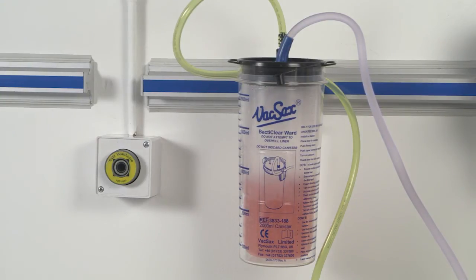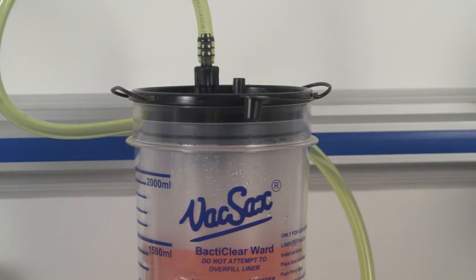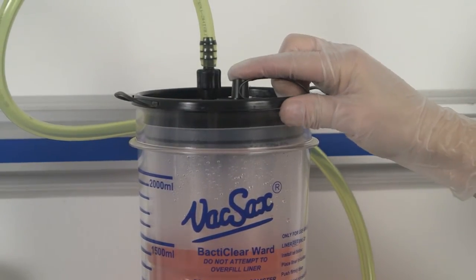Once the liner is full and with the vacuum still turned on, remove the patient tubing. Twist off the black cap located on the front edge of the liner top and insert firmly into the patient port.